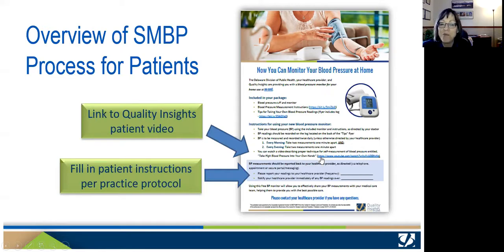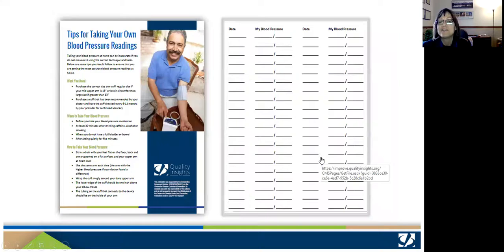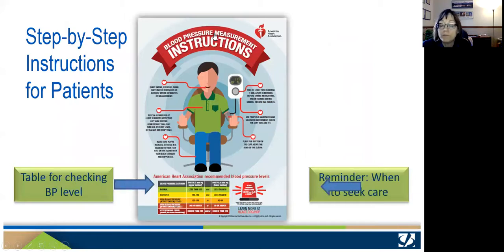Okay, well, you can always ask us your questions. So the second paper I have for you today is this one that says tips for taking your own blood pressure readings. It has a lot of the things that we're going to be talking about. You can read that at home. But what I really want to point out is the flip side, the back, because this is a blood pressure log, and you can see it has a space for the date, what your blood pressure actually is.